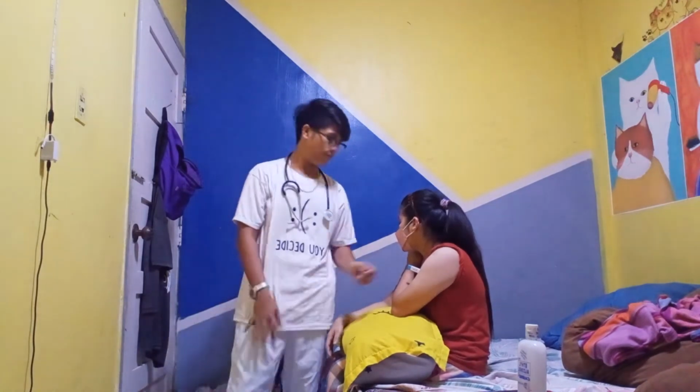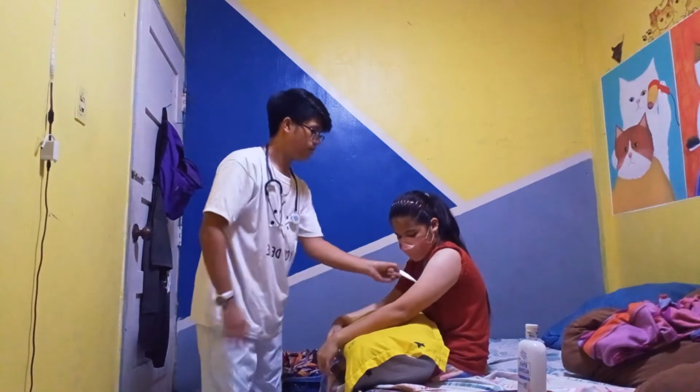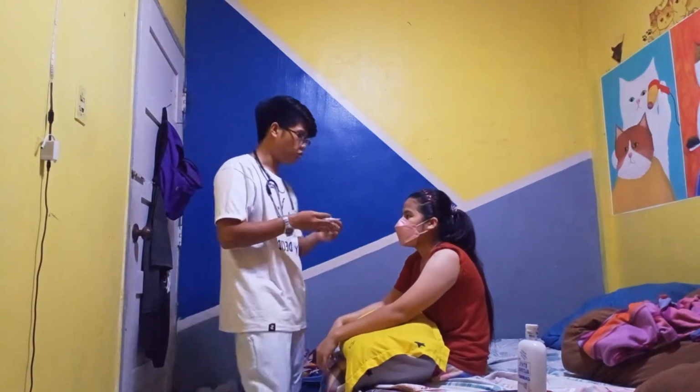So next is inform client of thermometer reading to provide participation in care and understanding of the status. So normal naman po yung kuwan natin, ma'am. So temperature nyo.